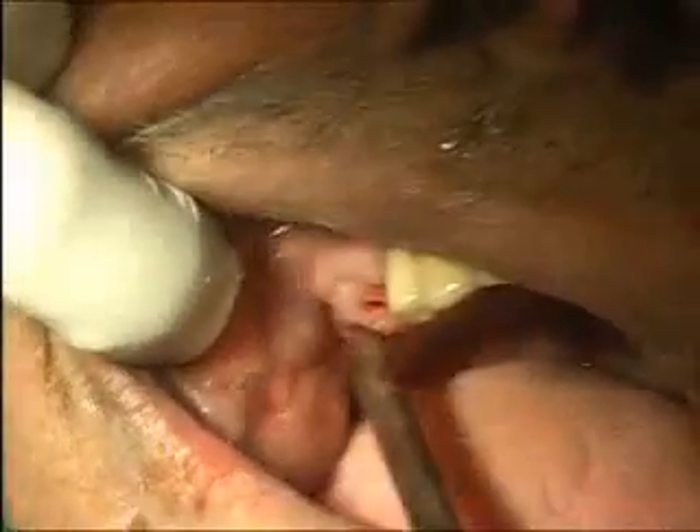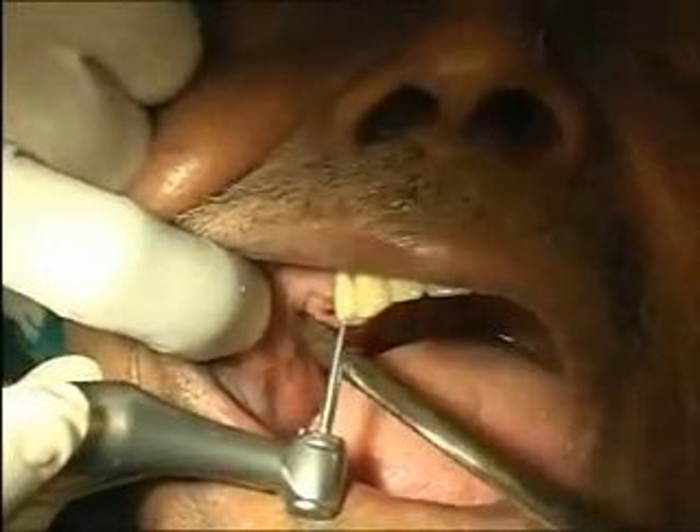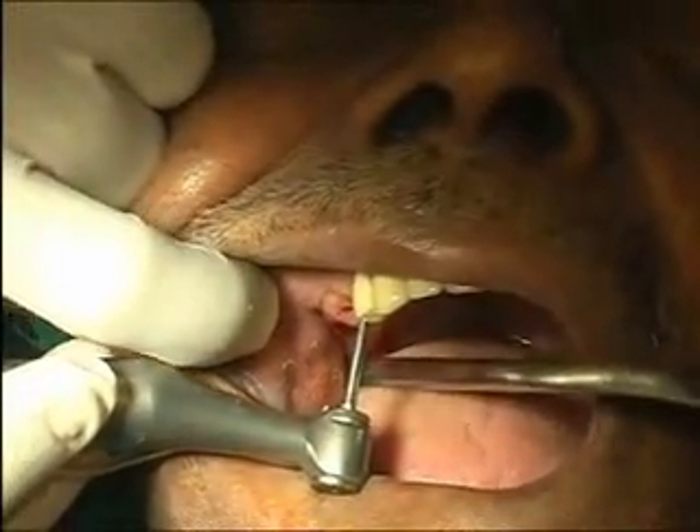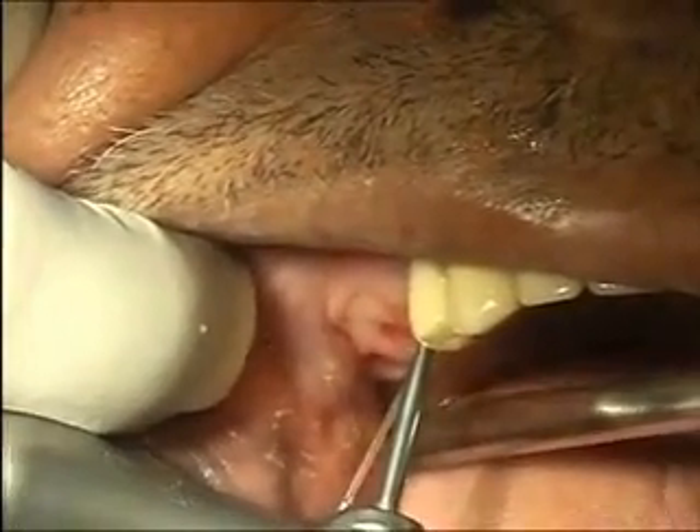One-stage treatment protocol. Look at that. This is such a tool. The round of the drill disappears.